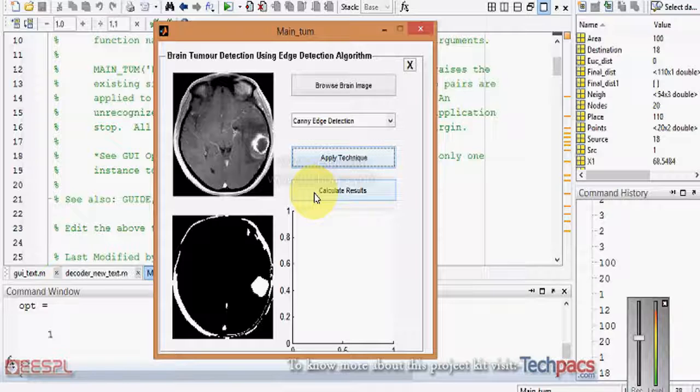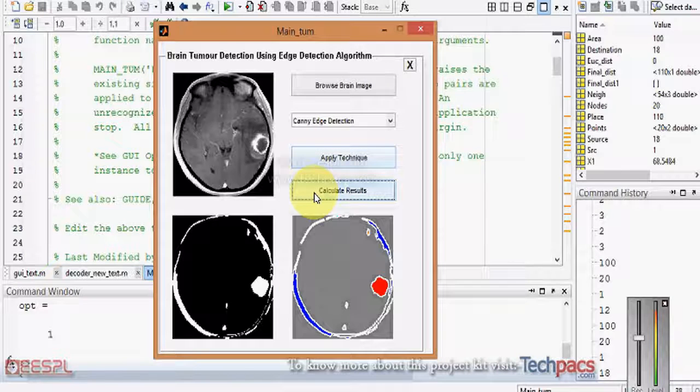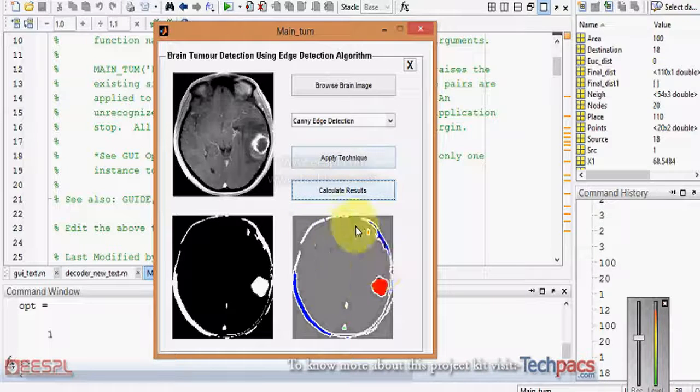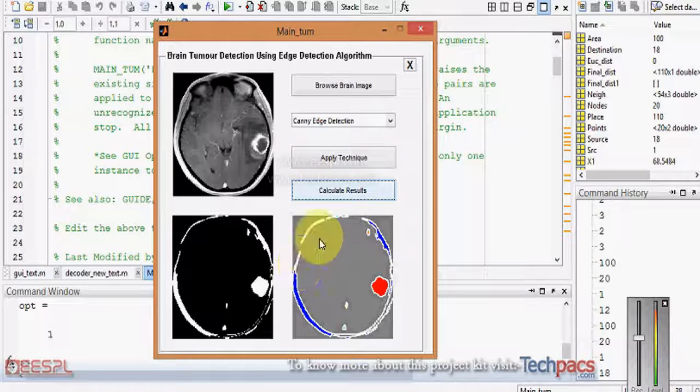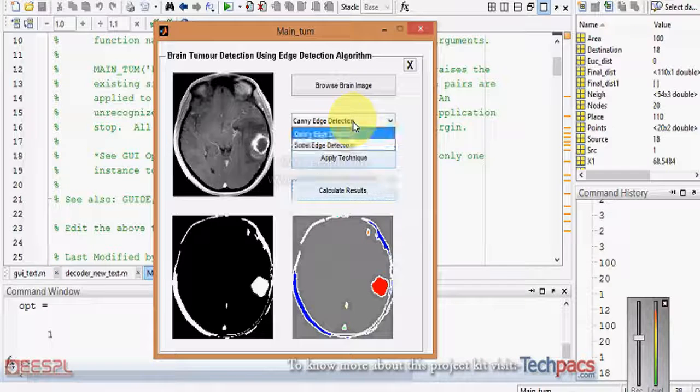When I click on the calculate result button, it will show me the segments having in the image. This is how we can work with different images and can use for the biomedical field.